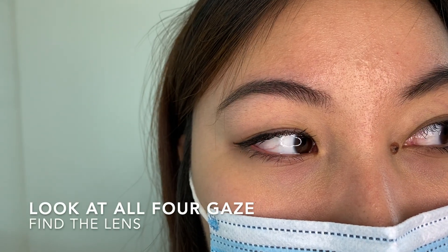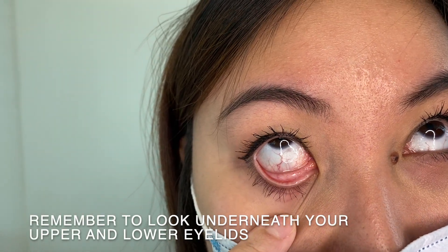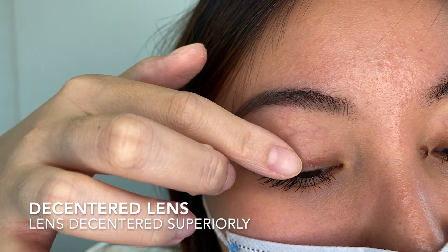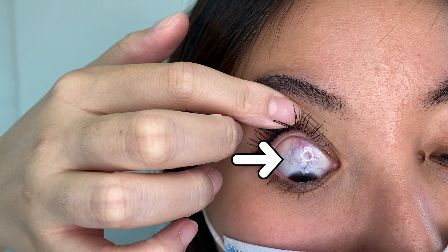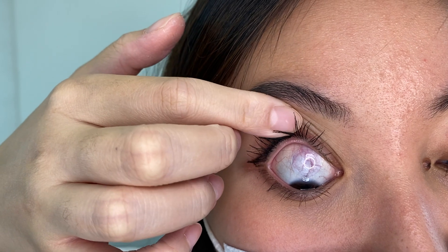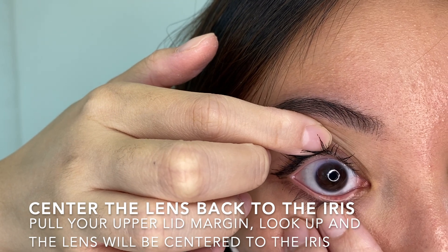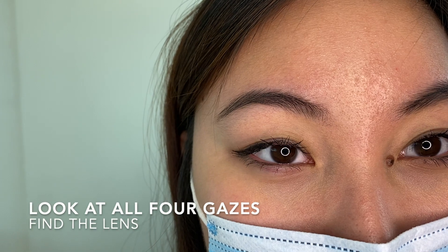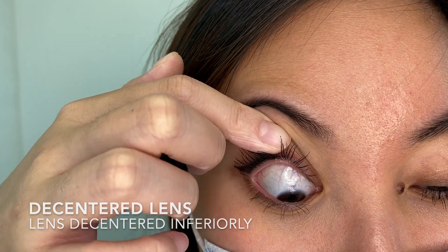If you are unable to find the lens nasally or temporally, remember to look underneath your upper and lower eyelids. The lens may be hidden underneath too. If the lens is displaced superiorly, hold your upper lid firmly and look upwards — your iris and the lens will interlock and be centred again. If the lens is displaced inferiorly, hold your lower lid firmly and look downwards. Your iris and the lens will interlock and be centred again.